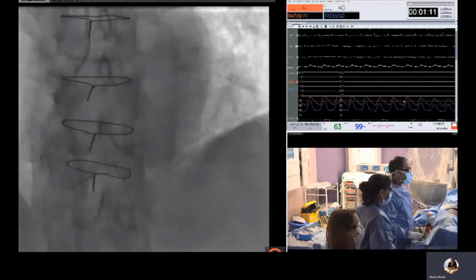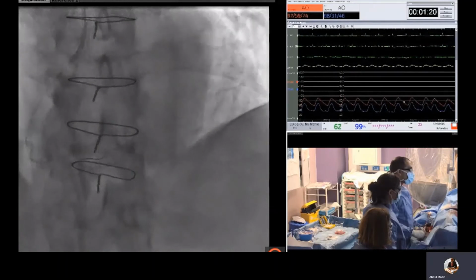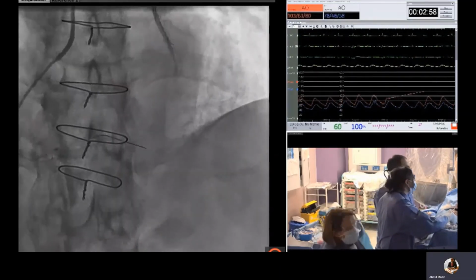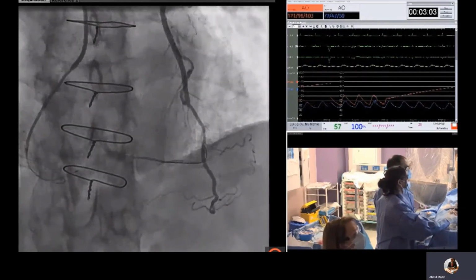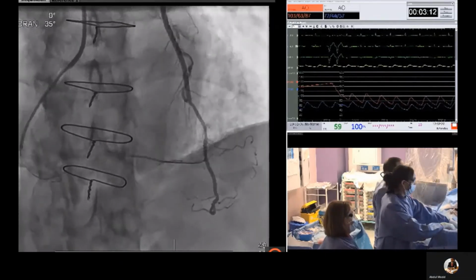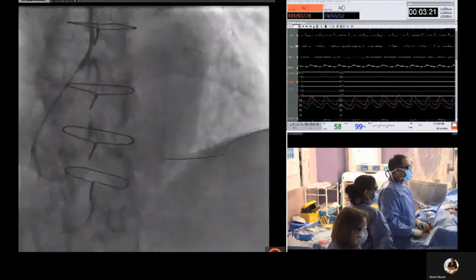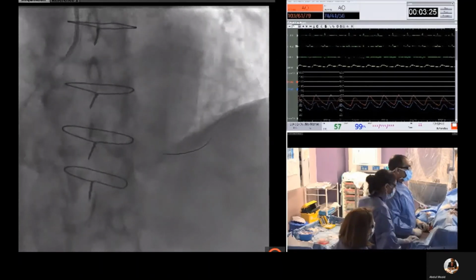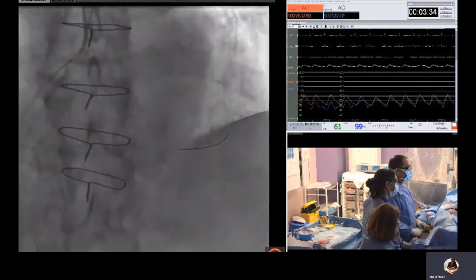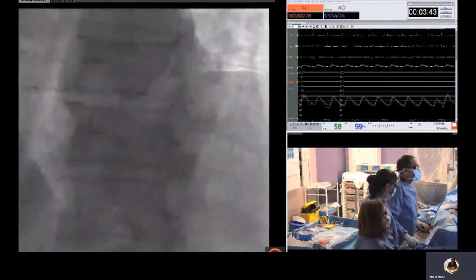So we then performed antegrade wire escalation with a Gladius wire. And in fact, this was fairly straightforward. And here again is injection from the left, confirming that the wire is in the true lumen. Then advance the Mamba Flex, and you can see that the vessel is heavily calcified and there is a lot of resistance. And this is one of the advantages of the Mamba catheters with the integrated tip.